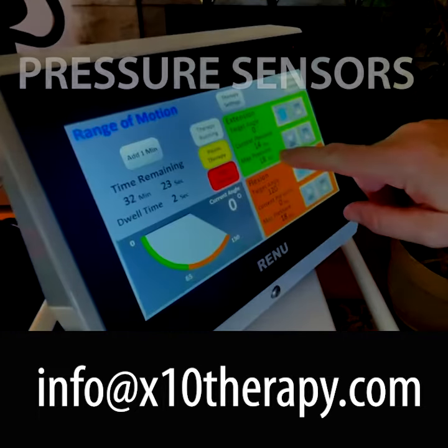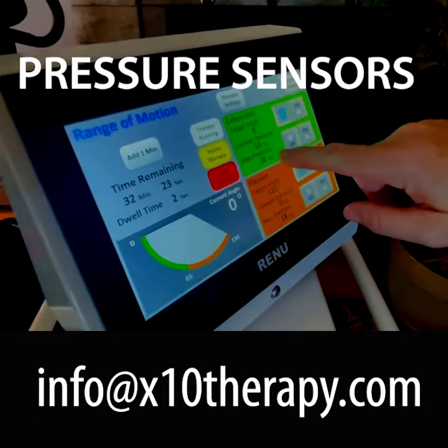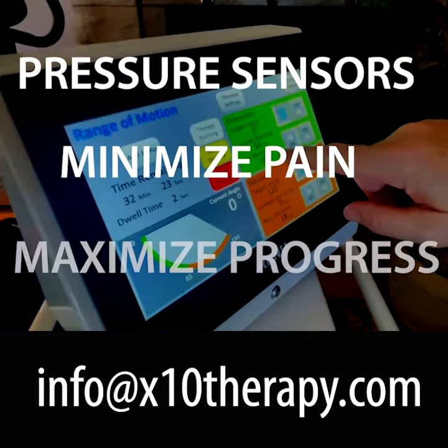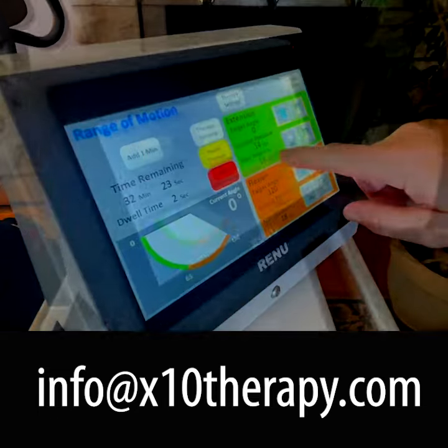The X10 reads your discomfort in the form of pressure. There are sensors in the arm that monitor the force that you're exerting on the machine. This allows the X10 to keep you out of pain, but on the edge of discomfort where you can make progress. The X10 has an easy-to-use touchscreen that is at the ready to give you information and allow you to work with the machine to stay on the edge of discomfort and make progress.